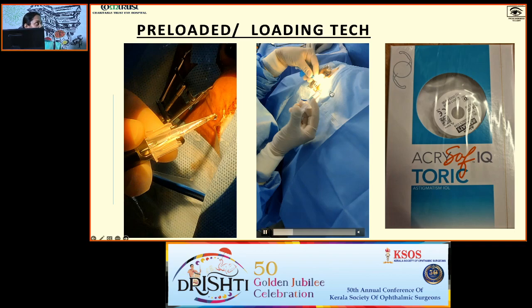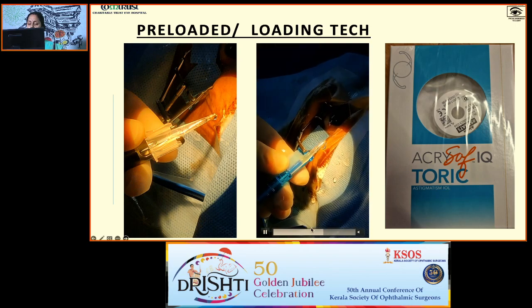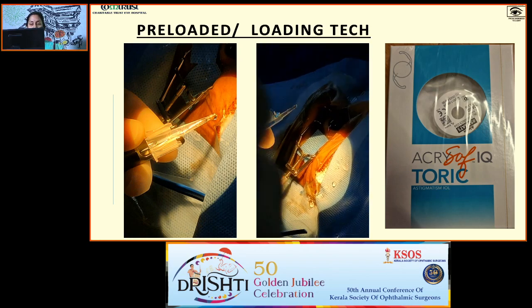Through the nozzle, saline has to be injected, and visco has to be injected through the nozzle and from behind. The flaps you can see have to be closed by removing the central flap separator. Once it is ready, you can check the movement of the lens by pushing the plunger.